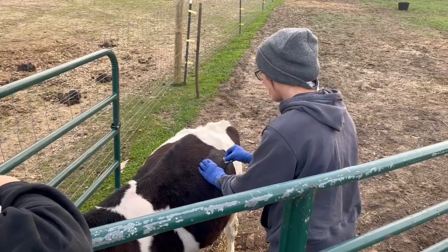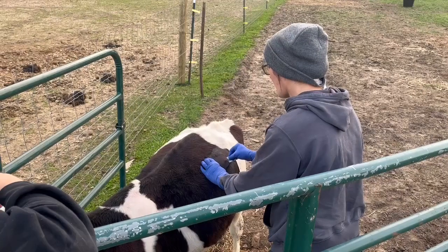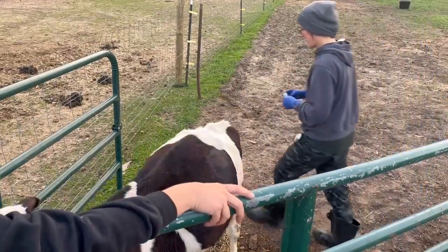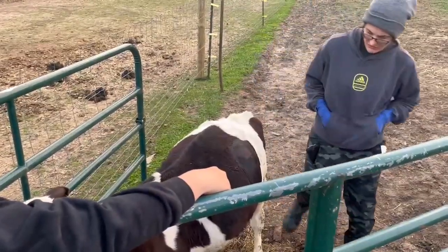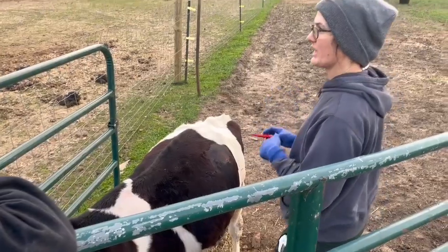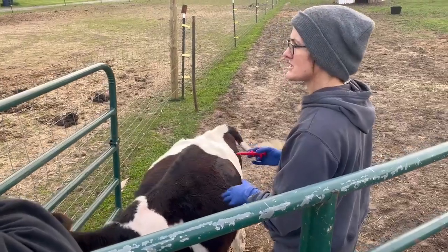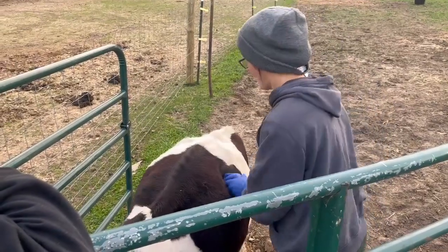It should be numb, but it's easier to go through all the way. Once you cut the skin, then if you pop through the whole nine yards, it's a little bit of a heave-ho, but once you get it in it should deflate. Then we twist it in, and this corkscrew thing hopefully will stay put — he's kind of small but it's got to stay put, otherwise you've got to do it surgically. All right, here we go — three, two, one.